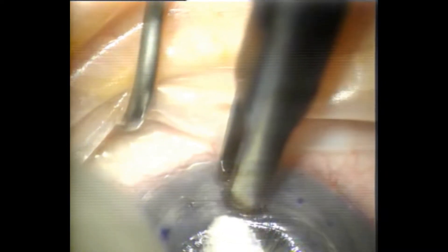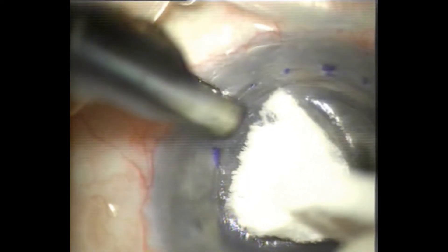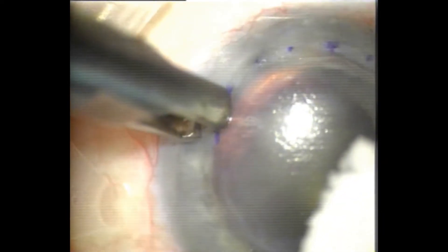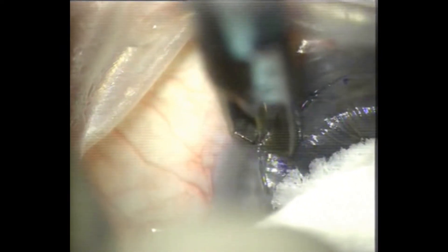As you see here — and swapping to the left hand, trying to continue along the previously marked area. Just going back with the right hand now and re-deepening.